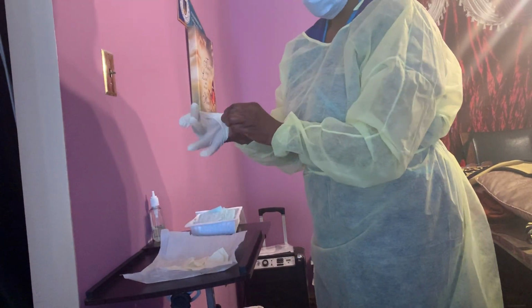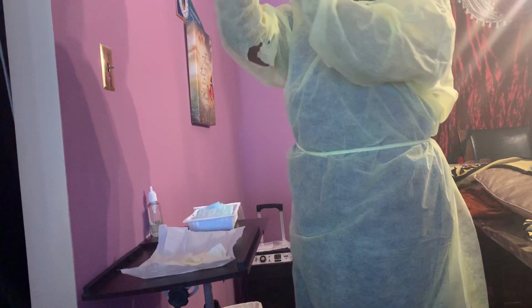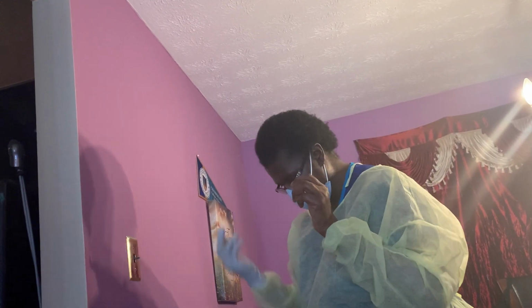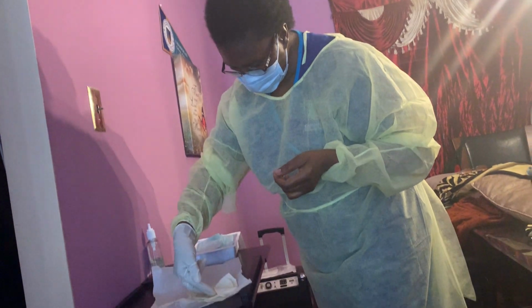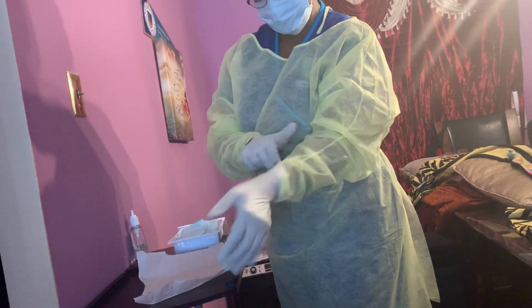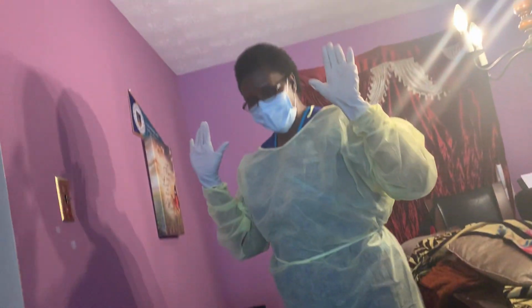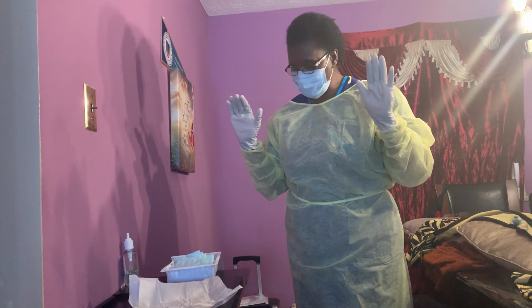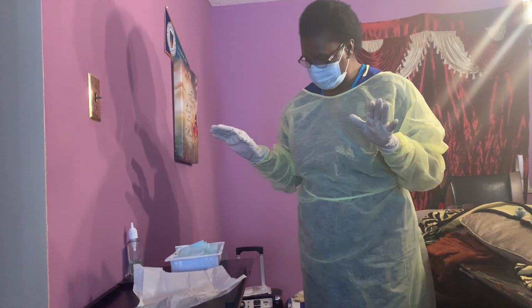Then from the outside, make sure it doesn't touch. Okay. Then I'll go inside. So I have my sterile gloves on. Now that I have my sterile gloves on, I'm gonna prepare my sterile field.